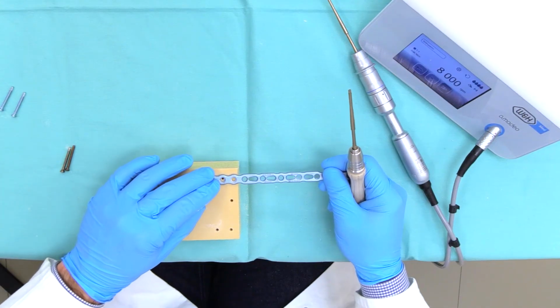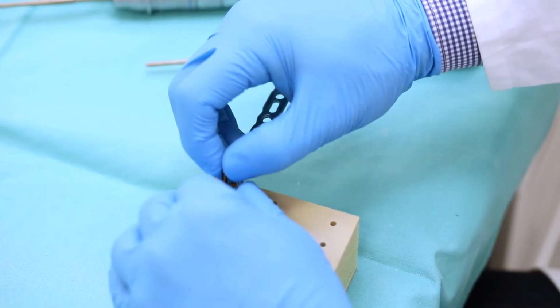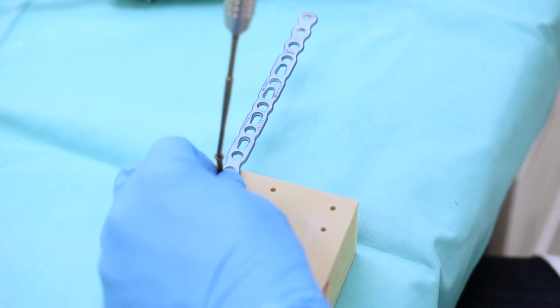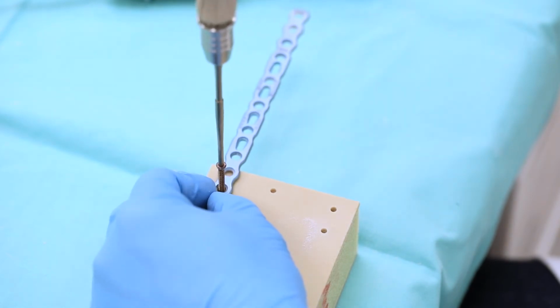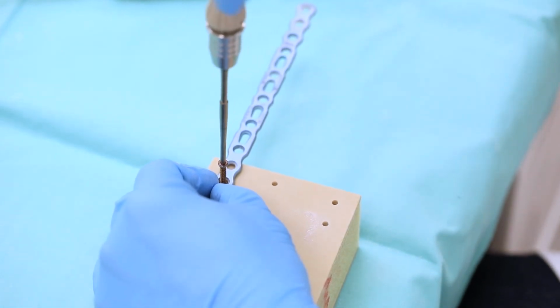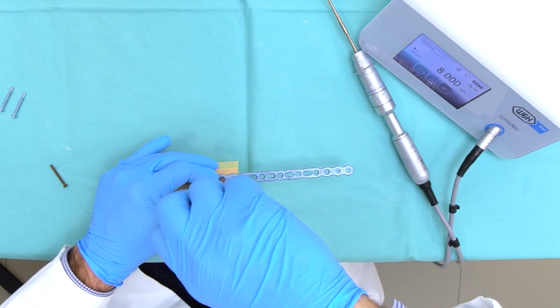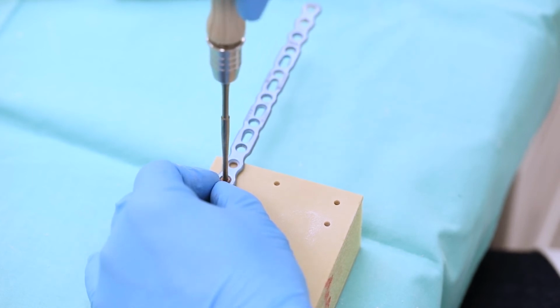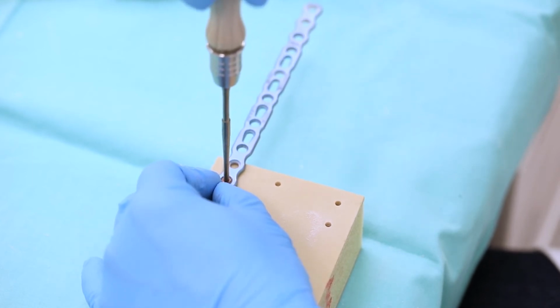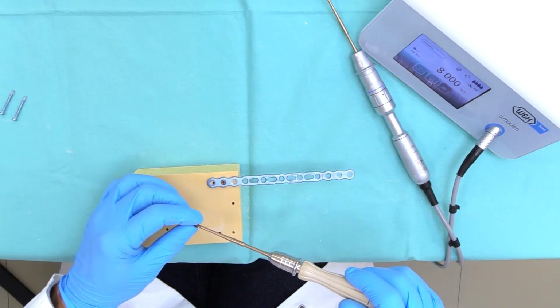We now use angular stable screws. The plate is also attached to the bone, but is not compressed to the bone. It acts as an internal fixator.